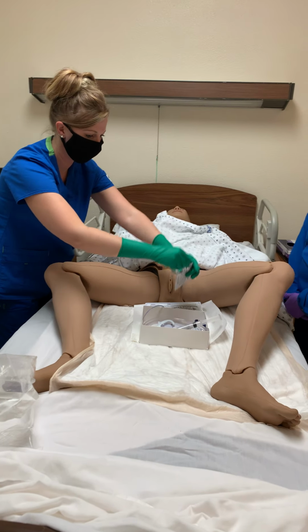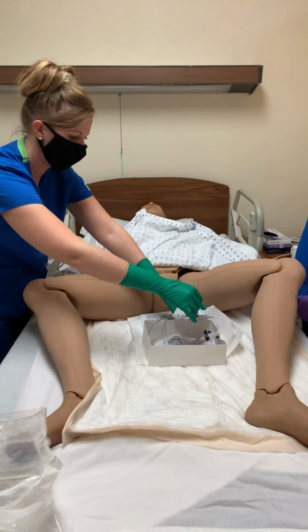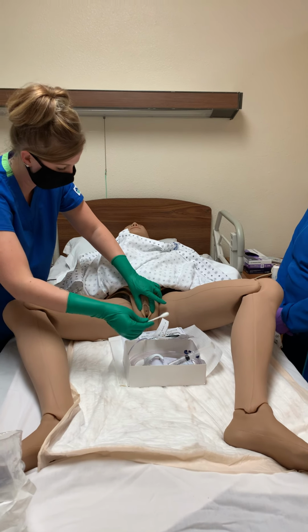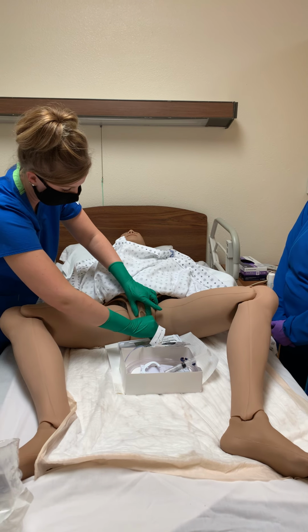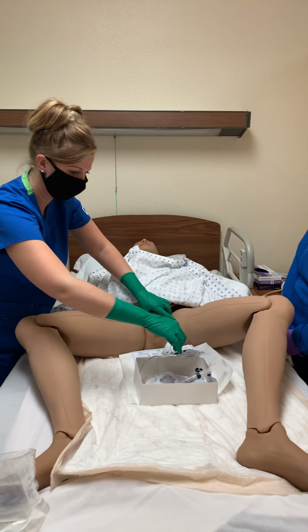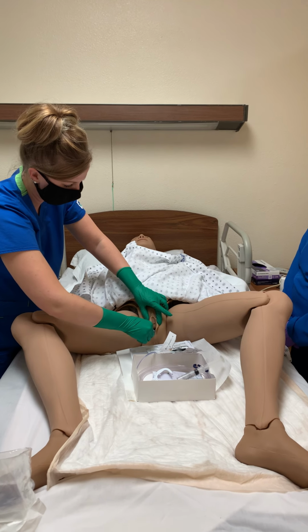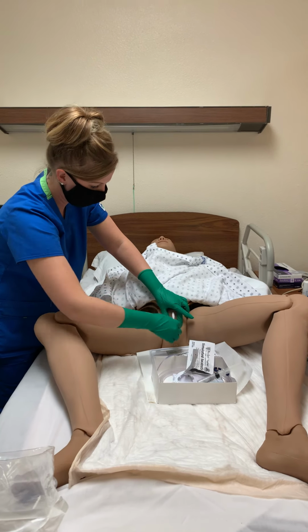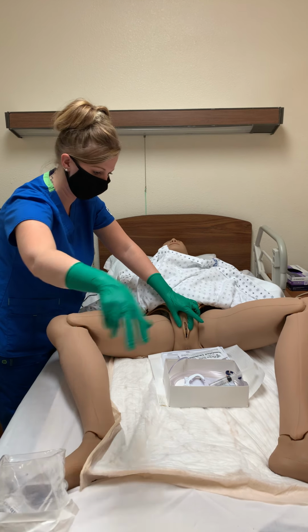So, I have my 3 here. I'm going to do one at a time. This hand is no longer going to be sterile because I'm touching Joanne. I'm going to go outside down, and I'm going to toss it in the garbage. I'm going to do inside down, toss it in the garbage, and then I'm going to do straight down the middle and toss it in the garbage. And that as well.